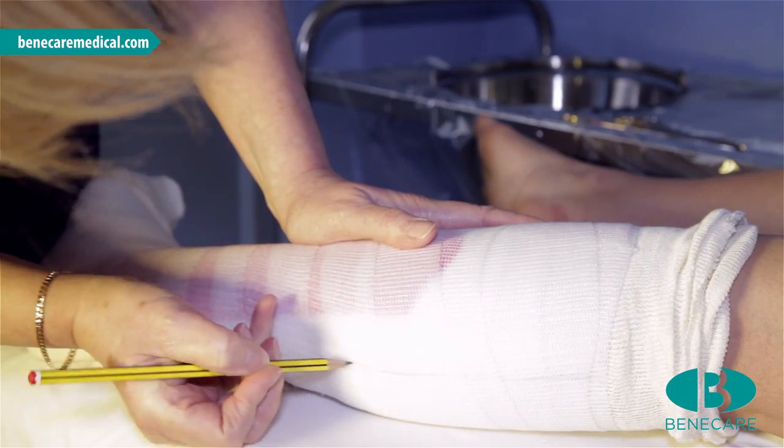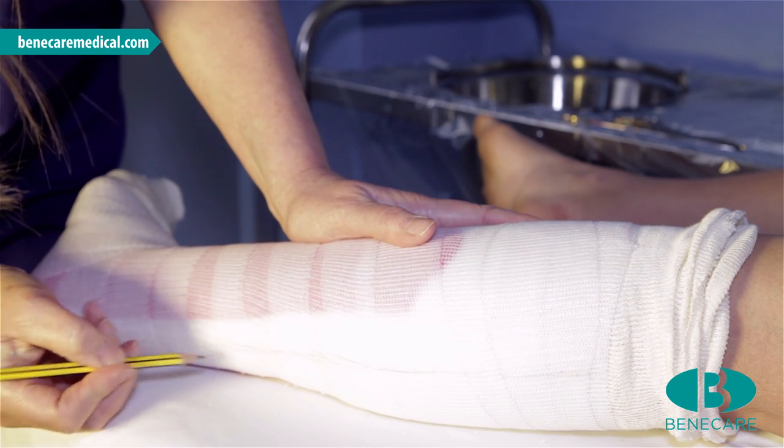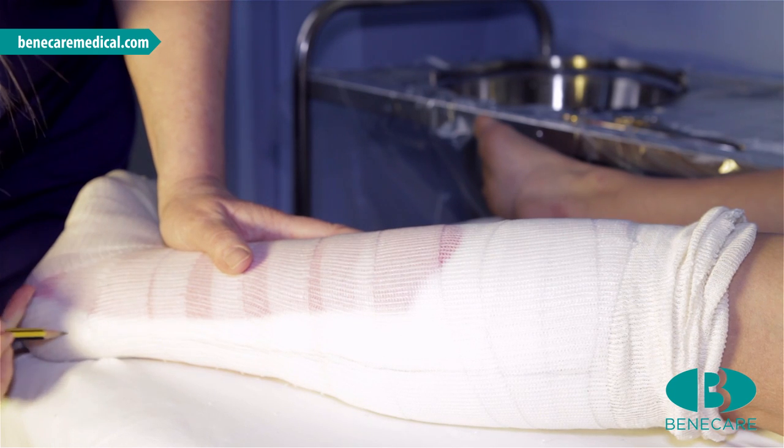Mark the cast for safe removal. Mark posteriorly, starting at the centre of the cast, moving down to the side of the Achilles tendon, between the malleoli, and around the calcaneum.